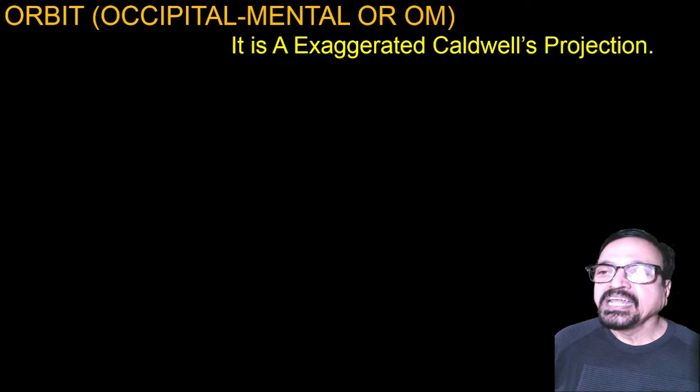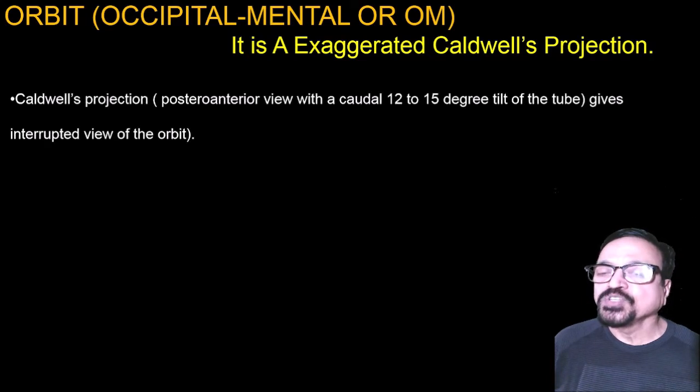Then the occipitomental, that is the OM. It is an exaggerated Caldwell's projection, so it resembles it with certain difference in angulation.